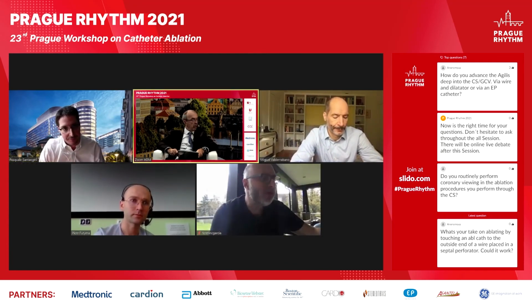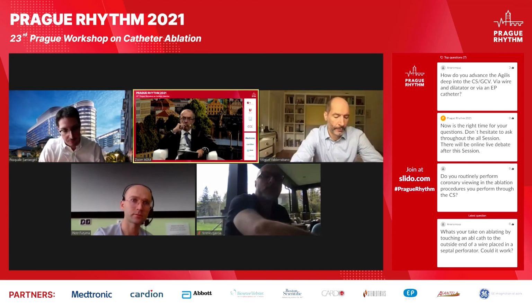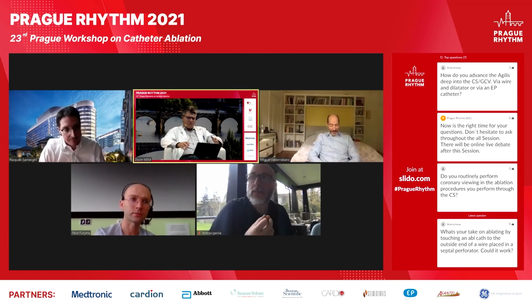Okay, is there any other question for Pasquale? Probably last question about HD grid. I have no experience with HD grid, but I can imagine mapping with this device or mapping catheter in the left atrium, right atrium. But how about the ventricle? Is it difficult to manipulate in the area of papillary muscles and so on?